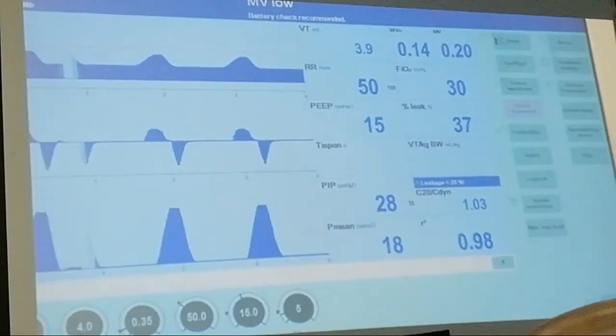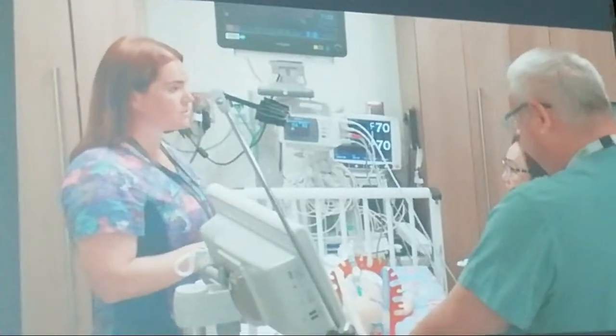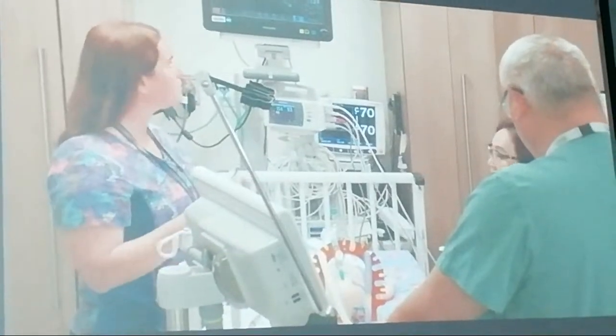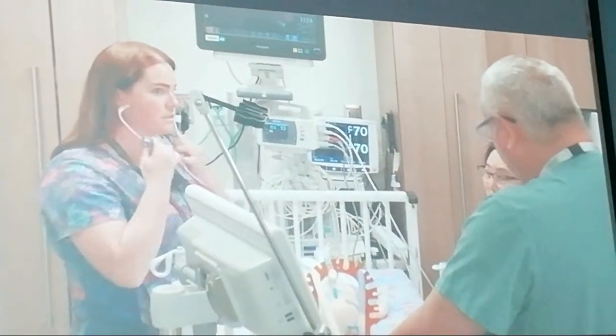Yeah, the vital signs have improved. The heart rate has come down to 154 from 170, so that's great. And as John mentioned, our sats are up to 93 now and on much lower oxygen. Our blood pressure has improved as well, and our tissue oxygenation has stayed the same. I'll just do a quick listen to hear for air entry.